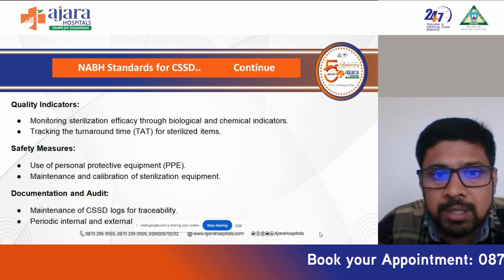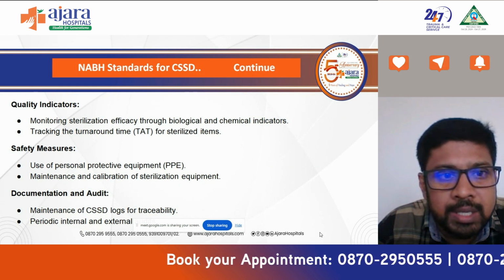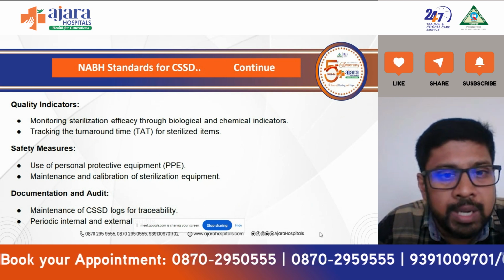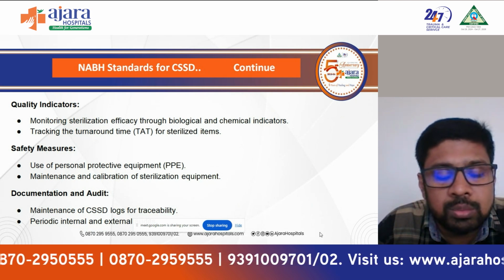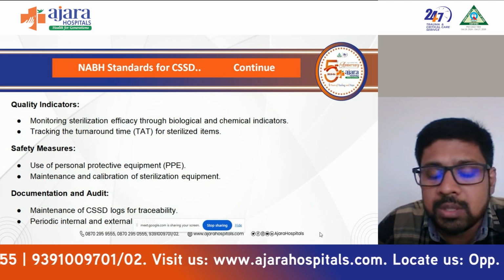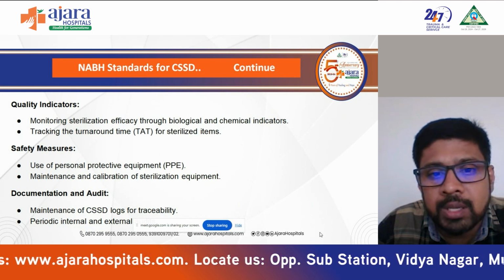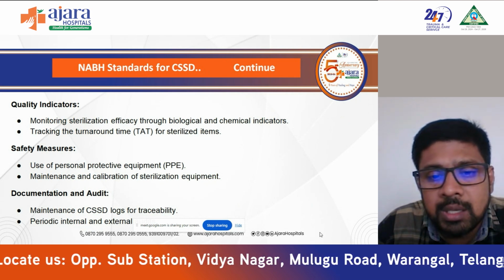Then we need to maintain some quality indicators. We need to monitor biological and chemical indicators, and turnaround time is very important. We need to maintain a book for the TAT, or online is also acceptable. Then we need to follow some safety measures: all the staff working in the CSSD should wear PPE. That is important, as it prevents infection.